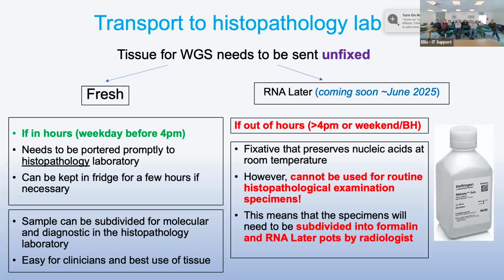But obviously, if this happens at the weekend as an emergency, which is often the case, sometimes you get these mediastinal masses and things like that, or if somebody's been added late onto your list and the lab's not open, there is this option of putting it in a fixative, RNAlater.